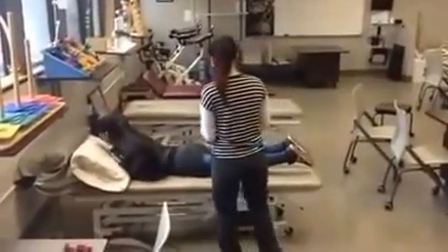The test is going to require a little bit of touching. Is it okay if I touch your leg? Yeah.